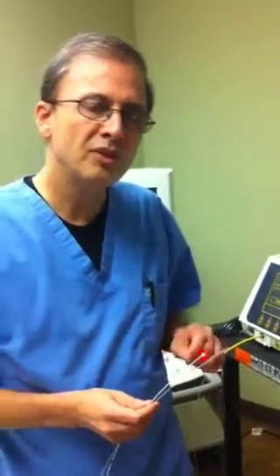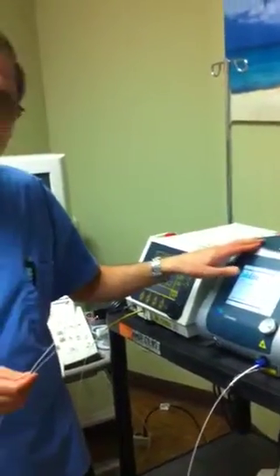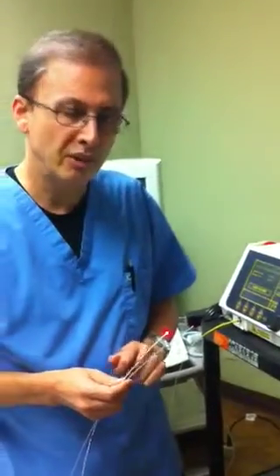With the previous systems, patients for the first two weeks after treatment would sometimes have intense pain at the inner thigh level. Now with this system we practically have no pain — we have tried this for about 20 cases and none of the patients have reported any pain.